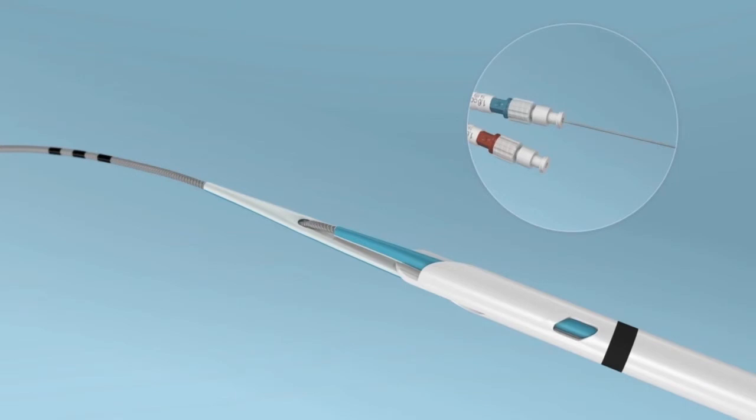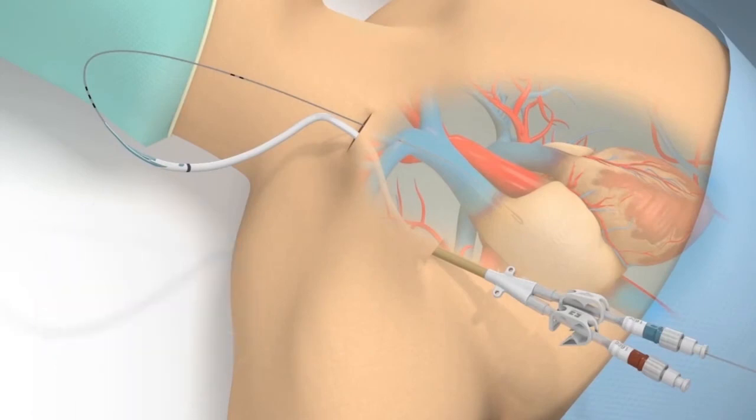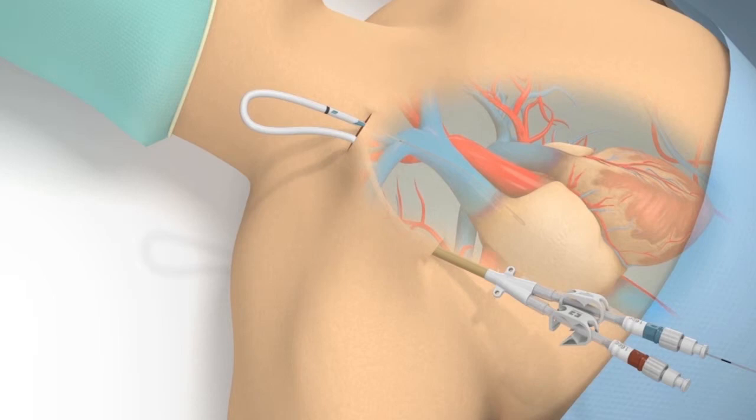While maintaining control of the guide wire, pinch the catheter stylet forcefully, approximately 2 centimeters from the distal tip. Advance the catheter into the vein while pinching the catheter stylet. Rotate in a clockwise direction to ease advancement. You will feel a resistance and distinctive pop as the catheter passes into the vein. Continue to pinch the catheter forcefully and advance the catheter stylet assembly until the catheter tip is positioned as desired. Use fluoroscopy to view and confirm catheter placement.